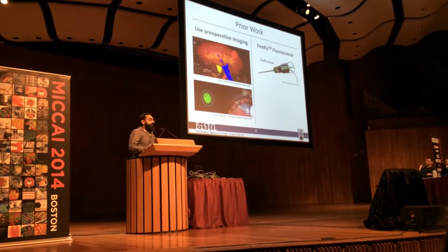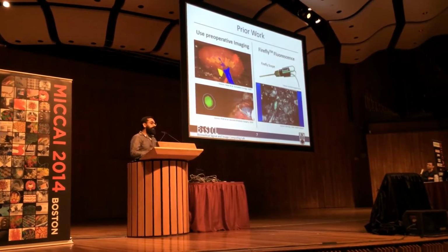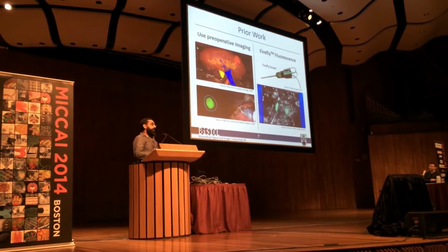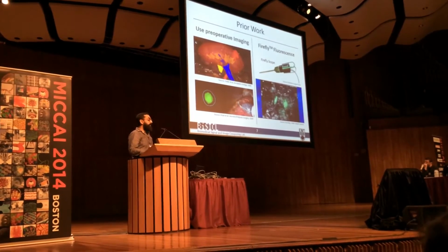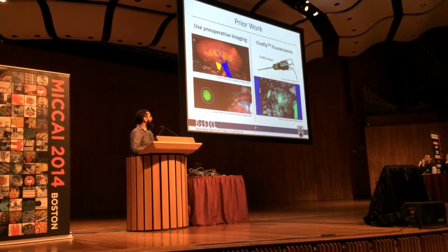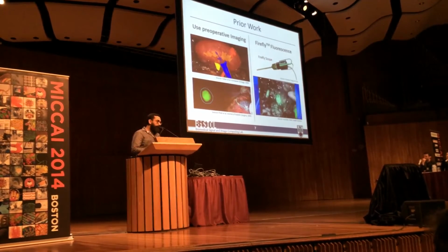Recent methods favor the use of fluorescence imaging, such as the firefly fluorescence imaging shown here. These methods are cost restrictive, are dosage dependent, require invasive injections of fluorescence dyes, and fail to identify vessels who are deeply occluded by fat. In these videos, you can see that only the visible part of the vessels are fluorescent.